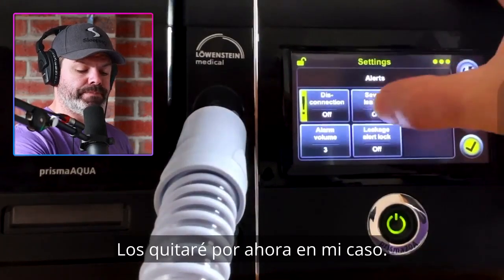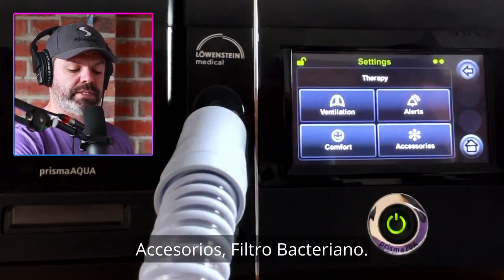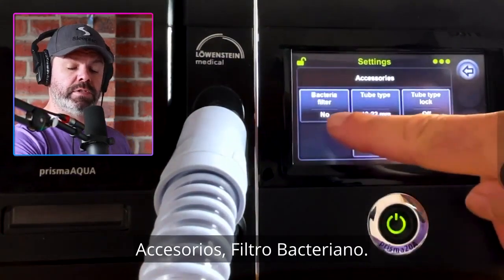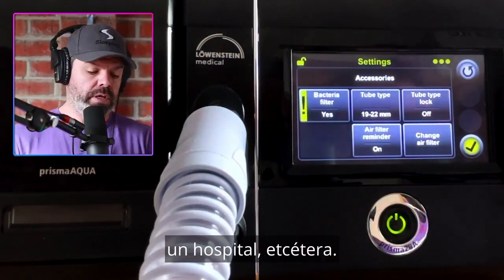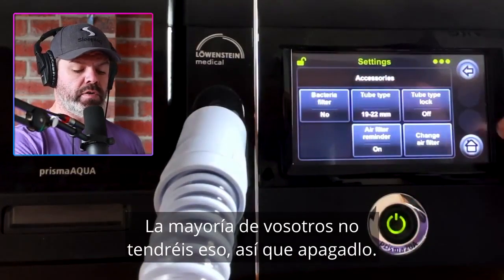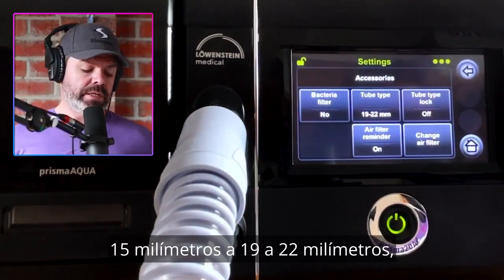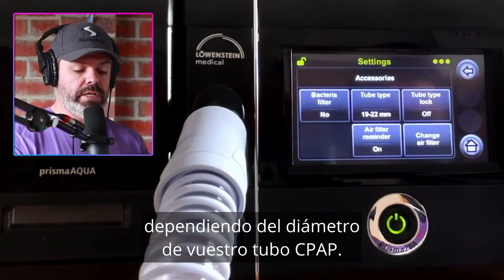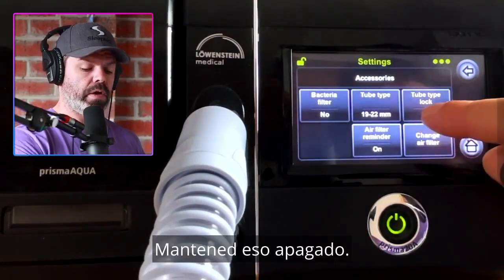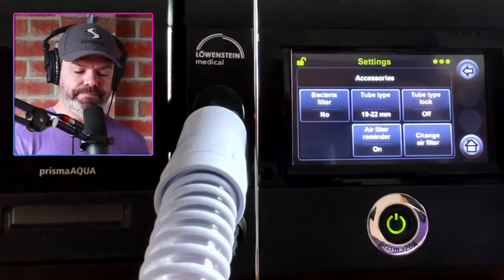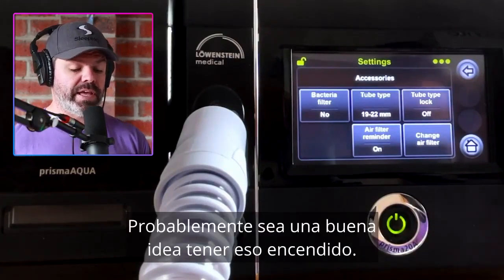I'm going to have the alerts off for now. Under accessories, we have bacteria filter — switch this on if you're running an inline bacteria filter in a clinical or hospital setting; most of you won't have that, so switch it off. We can change the tube type from 15 mm to 19 to 22 mm depending on the diameter of your CPAP tubing. The tube type lock is another clinician lock — keep that off. Air filter reminder can be on or off if you want the device to remind you to change your air filter — probably a good idea to have that switched on.